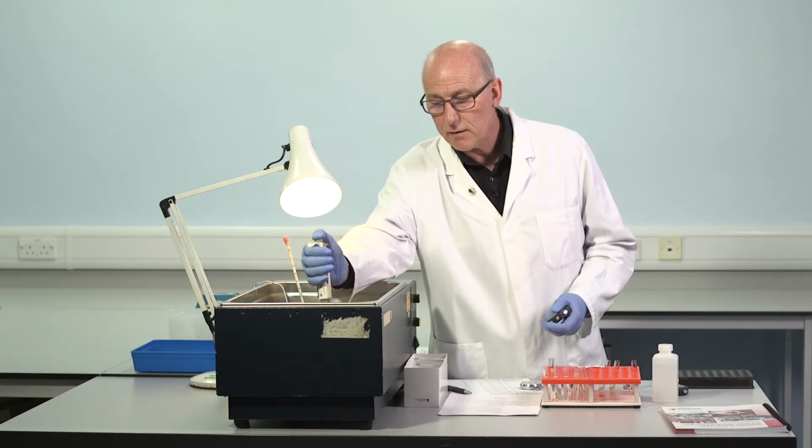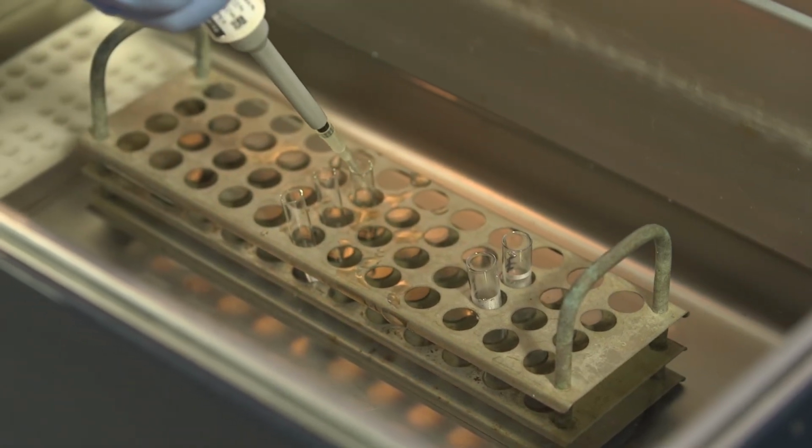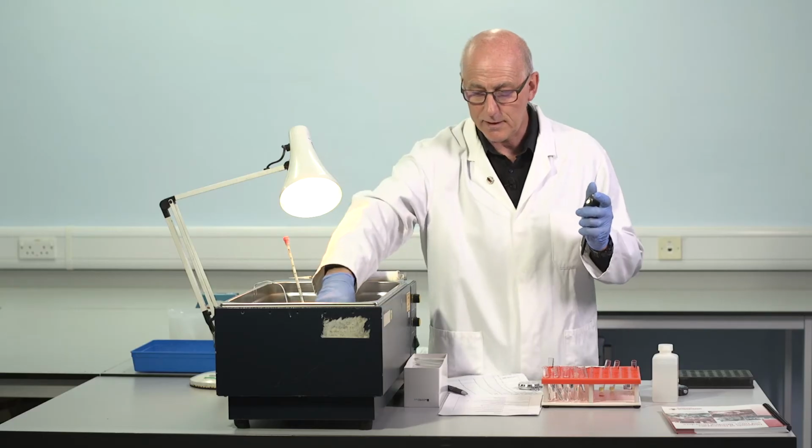So now at 3 minutes, calcium to the first tube, start the stopwatch, and mix.